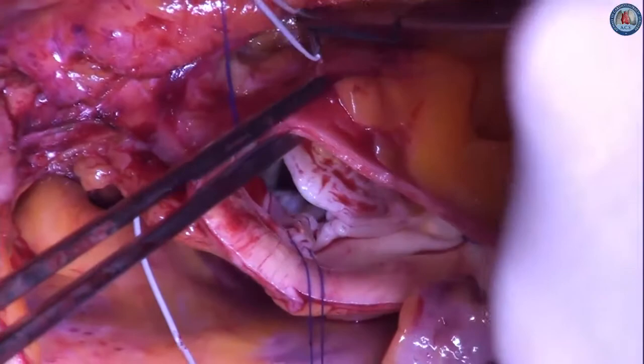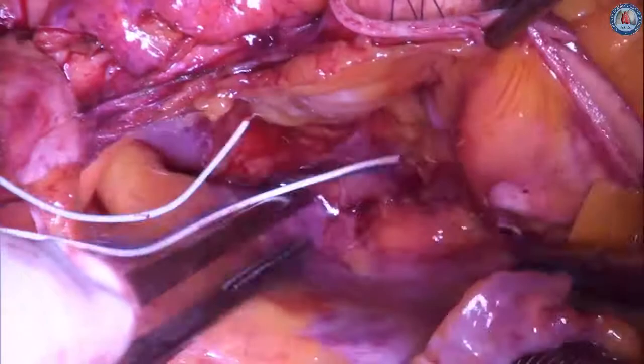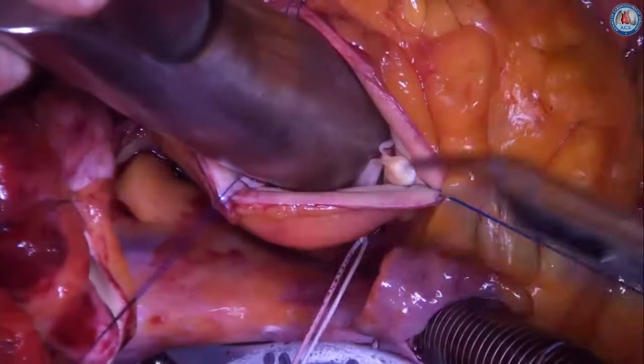The anterior arm is inserted through connective tissue outside the nadir of the right coronary sinus, and finally both arms are placed through connective tissue outside the nadir of the non-coronary sinus. The annuloplasty is tied around a graded Hegar dilator according to body surface area.